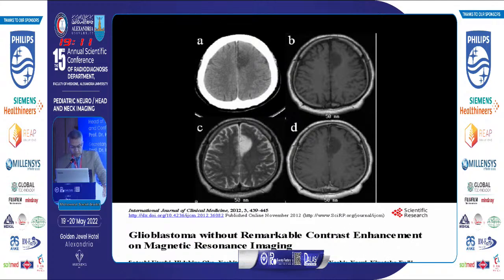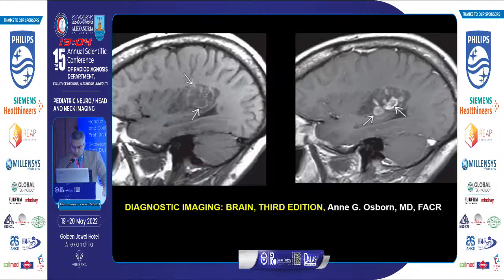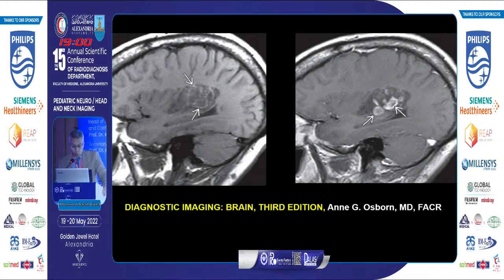An article by Satoshi demonstrated many glioblastomas without significant post-contrast enhancement. On the other hand, heterogeneous enhancement in a low-grade neoplasm, DNET, is also shown here.